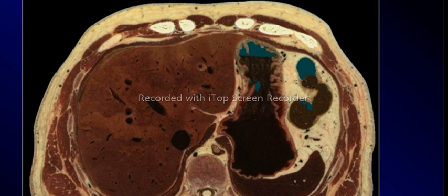This is further down as we go towards the feet, or caudally or inferiorly. This is still your liver there. This is your IVC. This is the diaphragm. And then you have the amount of lung or thoracic tissue there decreasing. This is your vertebral body. This is spinal canal. This is your diaphragm there. And a small, thin amount of lung tissue left.